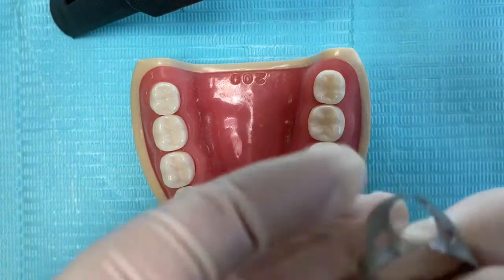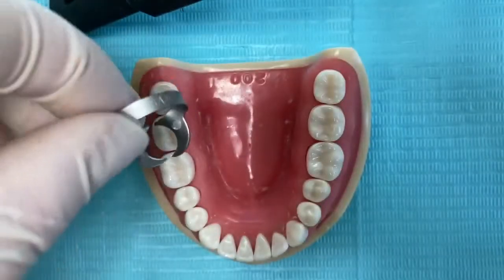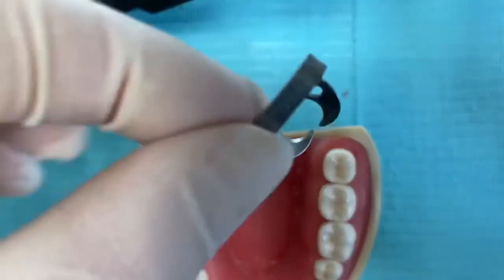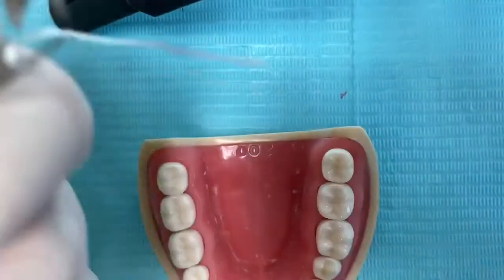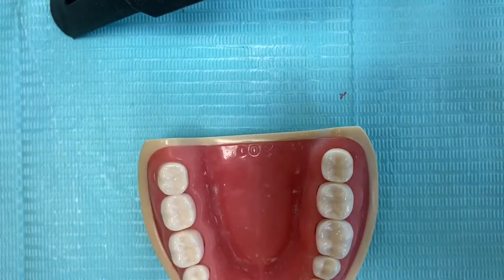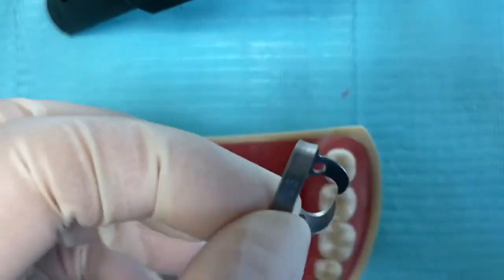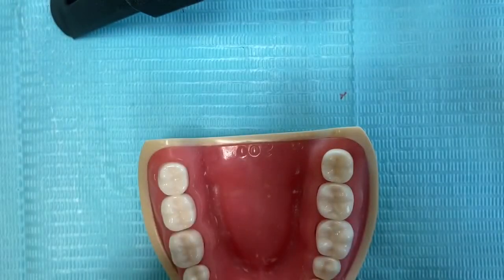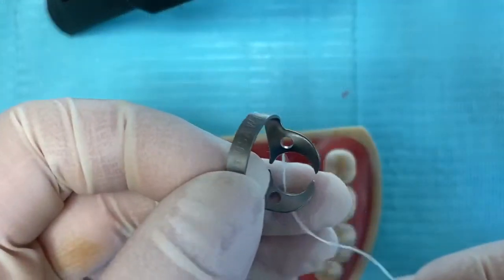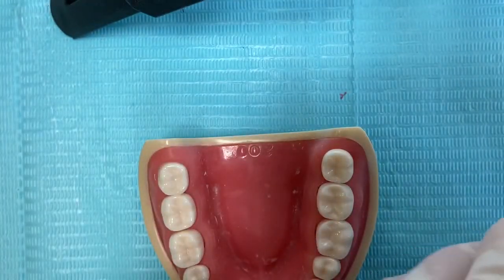We'll start with the easiest method: placement of the clamp followed by the rubber dam. But first, we have to ligate the clamp with dental floss. The reason we tie dental floss around the rubber dam clamp is to prevent aspiration or swallowing of the clamp in case it falls or moves during the procedure.